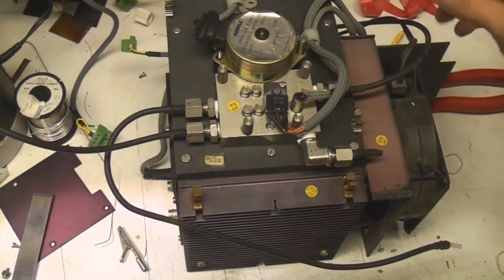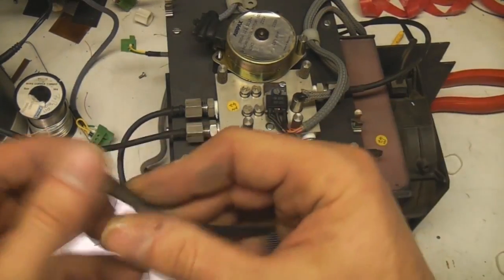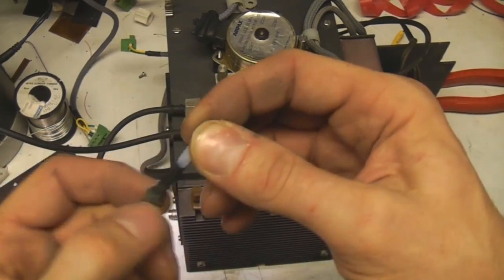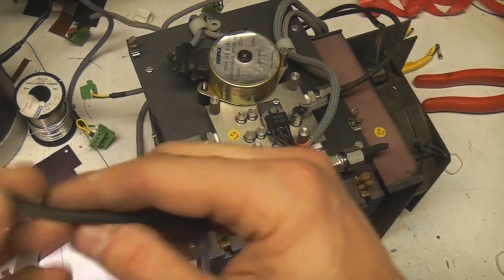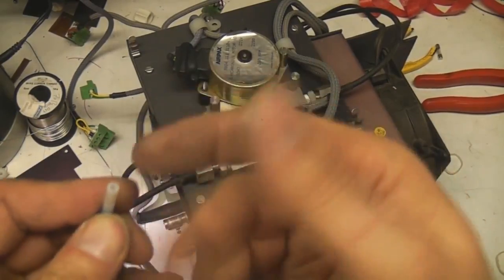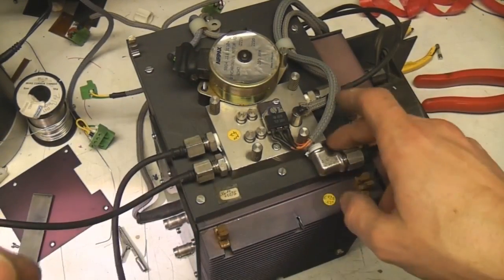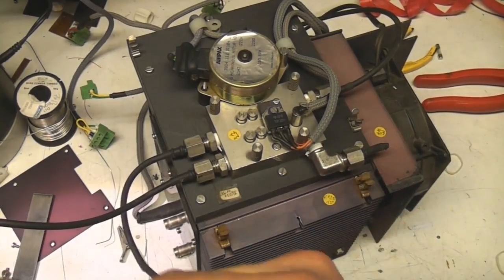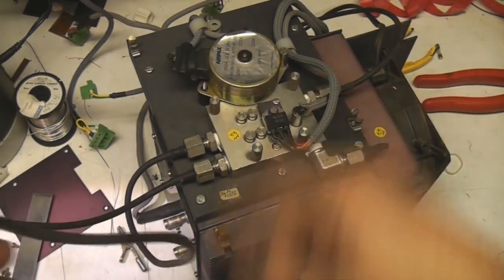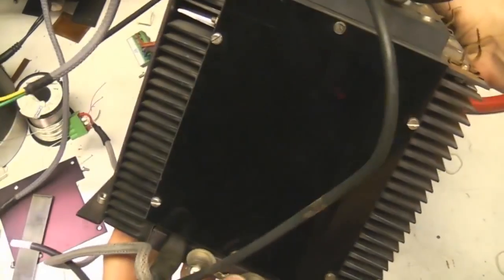Here's the main reaction chamber part where all the magic happens. One thing I noticed: they use plastic tubing throughout the thing, but all the tubes going into here have actually got black heat shrink over them. I'm sure this is just to prevent these tubes acting like fibre optics and transmitting light into the chamber. Bear in mind this is going to be an extremely sensitive light detector, so the last thing you want is your plastic gas tubes conducting light into your reaction chamber.